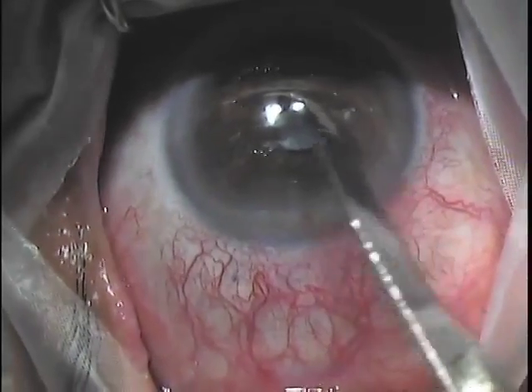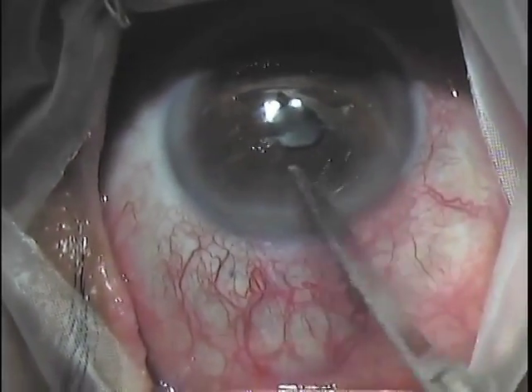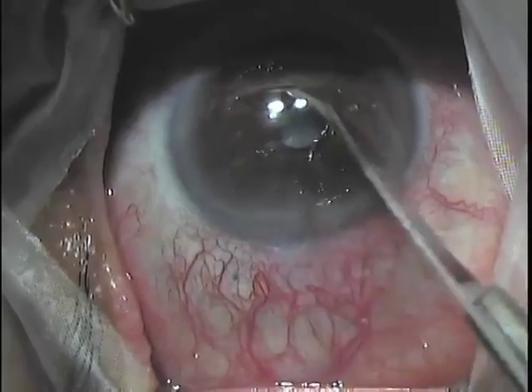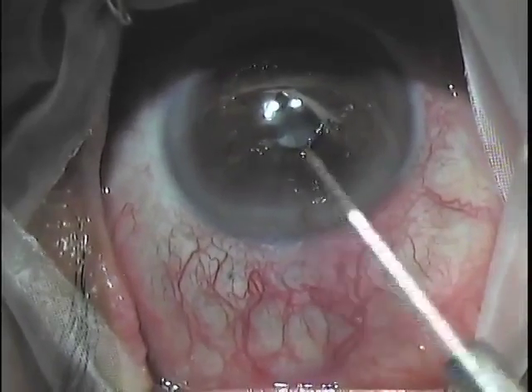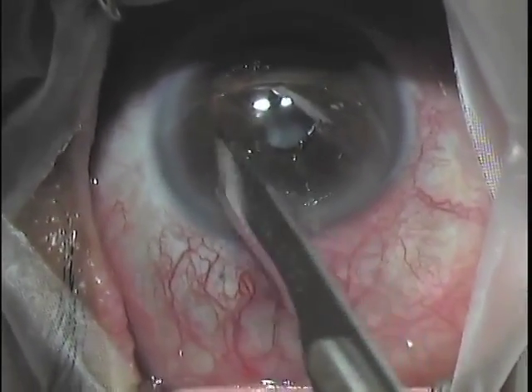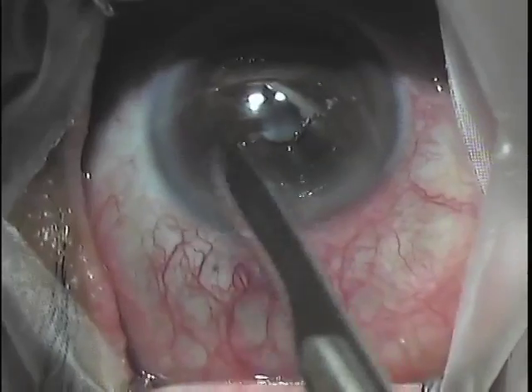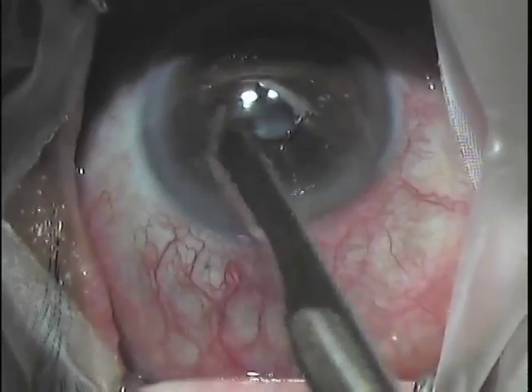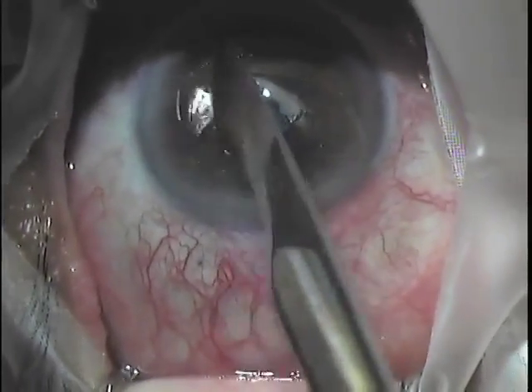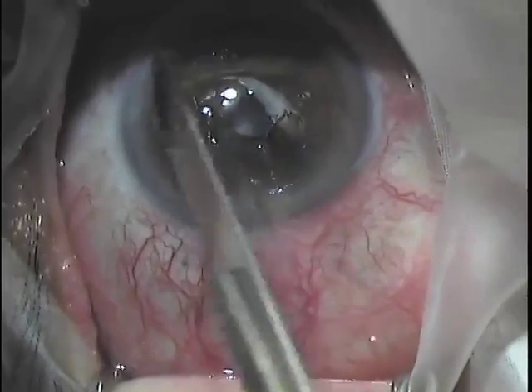Hi, this is John Hovenessian. This video shows the use of the Ambiolens amniotic membrane disc. This is a patient who had a non-healing corneal epithelial defect caused by prior exposure to mitomycin for treatment of an ocular melanoma.